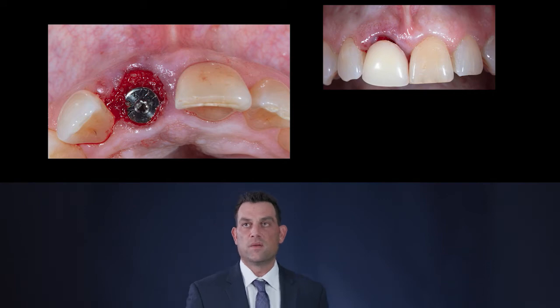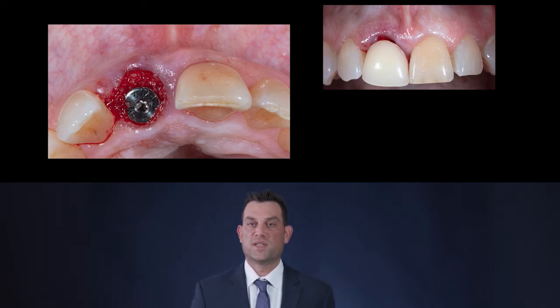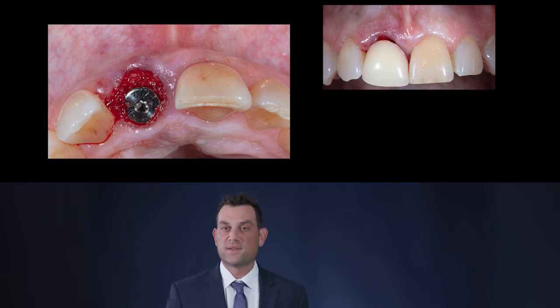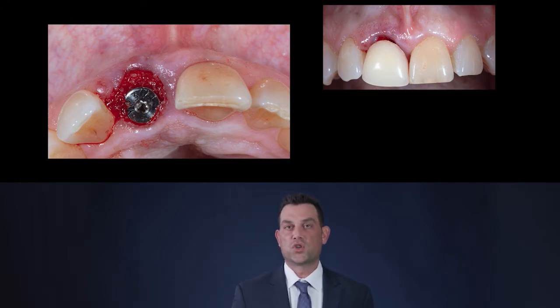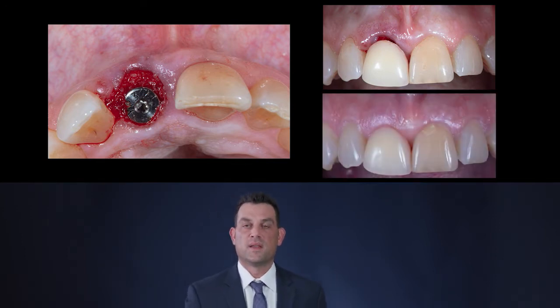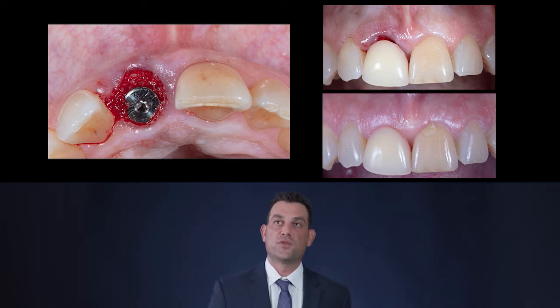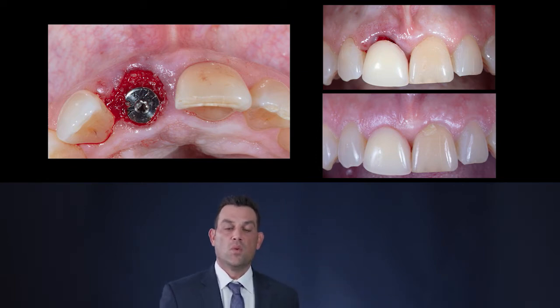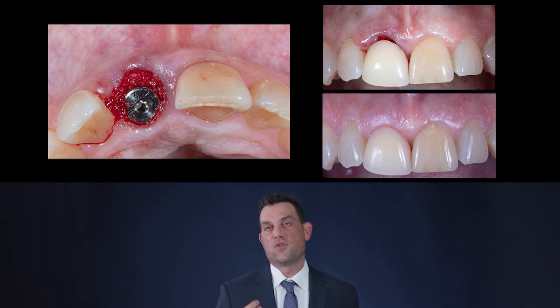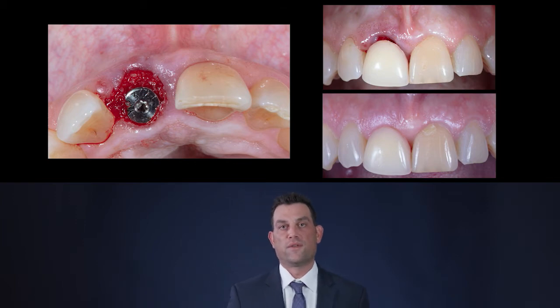As you can see here, I delivered the immediate partial directly after implant placement. I thought about adding some acrylic material to the cervical aspect of this pontic, but this case really exemplifies the need to allow biology to do its thing. As you can see, after just 1 to 2 weeks of healing, we have really incredible atraumatic healing, and we're able to maintain that interdental marginal soft tissue, which is so critical for final aesthetics.